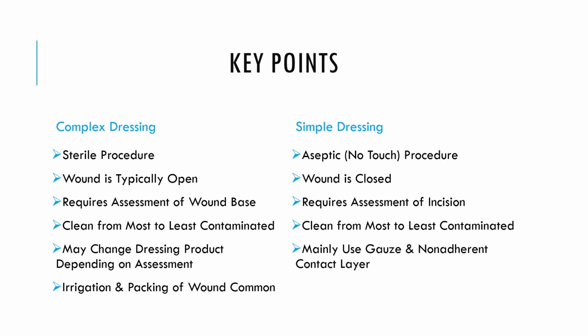If the doctor ordered 2 days, but your dressing is visually soiled or it's coming off, then you need to either reinforce the dressing or redo the dressing. Whereas in the simple dressing, it's usually gauze or a non-adherent contact layer that I have already shown you in a previous slide, like an Adaptic.